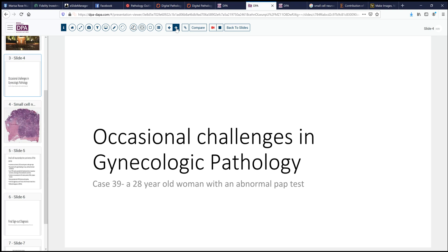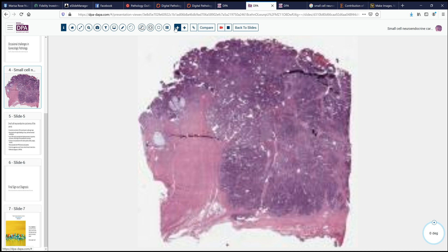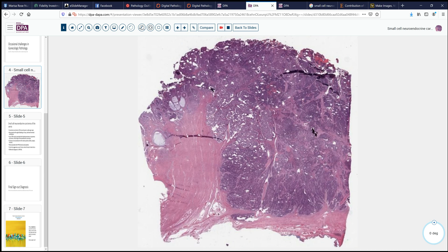A very interesting case: a 28-year-old woman who presented initially with an abnormal pap test and on exam was found to have a mass that was not your usual finding. She ultimately came to resection, and here is a representative section of her cervix.